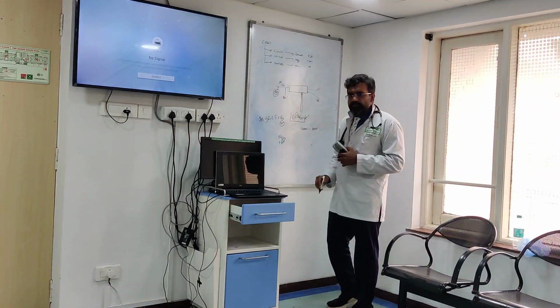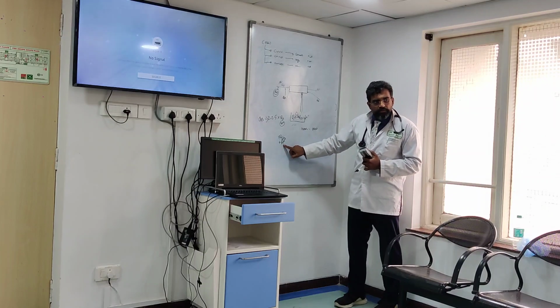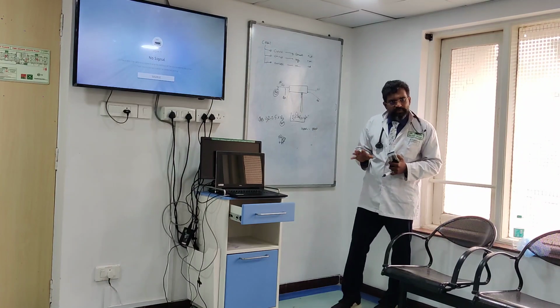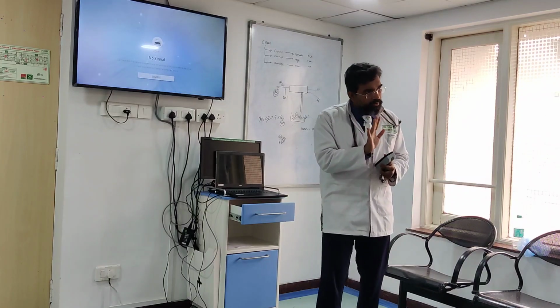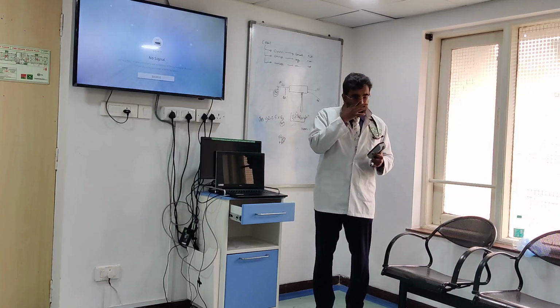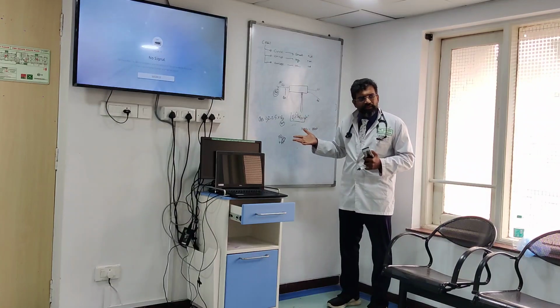More than 2 to 2.5 times? 2000 versus 9000. So if I put this like this, in no way my filter will get clotted. Clear? Is this irrespective of the citrate pumps? Irrespective of everything. Well, of course, that is also part of it, but the chances of it clotting is almost unlikely if I use this.